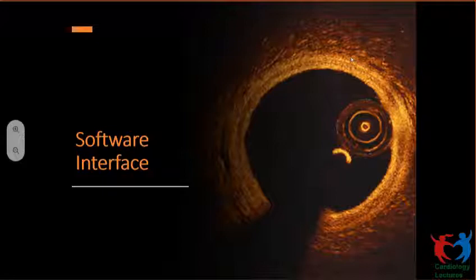You have to just ensure that the platelets are not active enough to stick onto that patch and initiate the coagulation cascade. So if your antiplatelet therapy is right, you can just leave them alone. So you suggest that if they are young patients, then better leave them, don't do this intravascular imaging, keep them on antiplatelets, antithrombotic, and then if required, do it after 3 to 4 weeks. Absolutely. Thrombus burden is going to dictate the imaging.